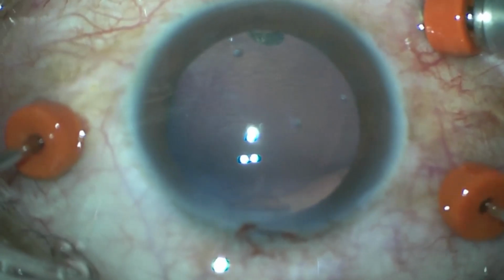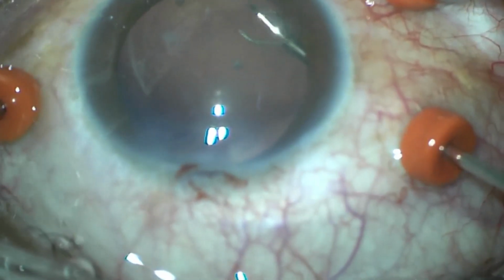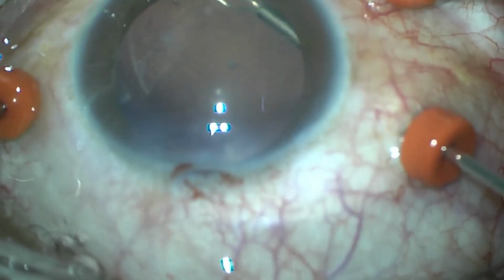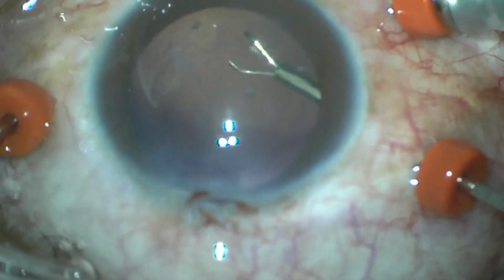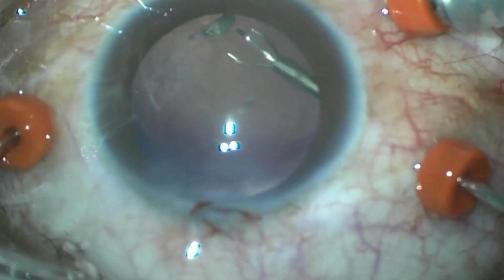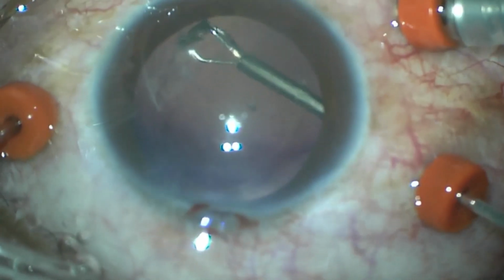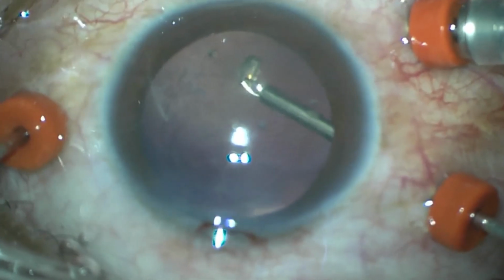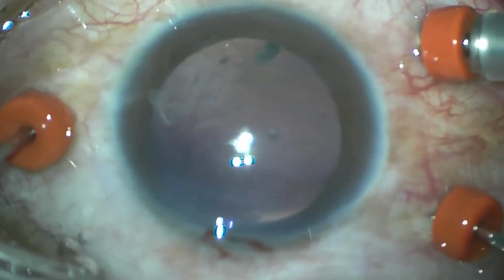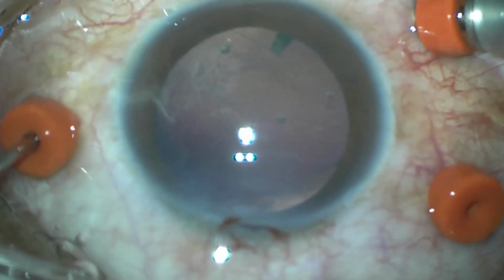This is where we have started the surgery, and we have finished removal of the crystalline lens. Here, instead of doing a complete vitrectomy, because the foreign body was presenting just behind the posterior capsule, I decided to remove it from this location only. The problem with this location would be that it is entangled in vitreous, so there would be some traction on the vitreous. But I decided that we can do some trimming of the vitreous and free the foreign body.